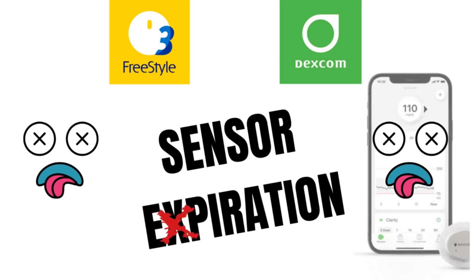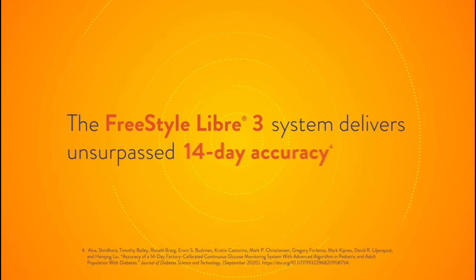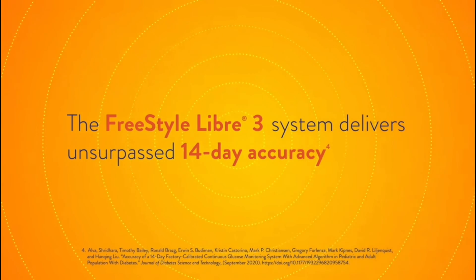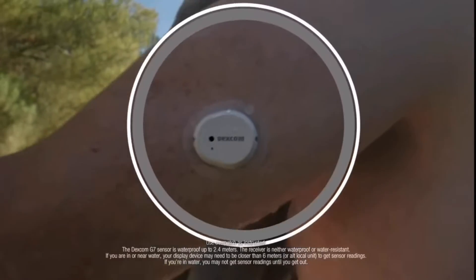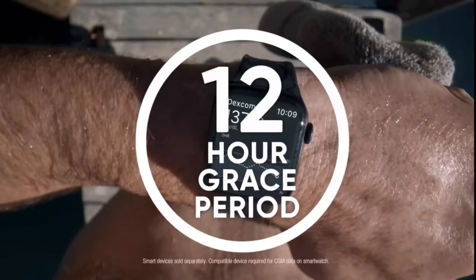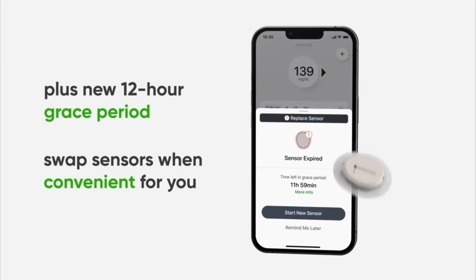Next, let's talk about sensor expiration — how long can you wear these CGMs until they reach the end of their lifespan? The Libre 3, just like its predecessor, lasts a total of 14 days, which is really nice — you get two full weeks out of the sensor. The Dexcom G7 lasts a total of 10 and a half days. The half day is because at the end of 10 days, it actually has a 12-hour grace period — something new with the G7 that allows the sensor to keep working for an additional 12 hours beyond the 10-day wear time.